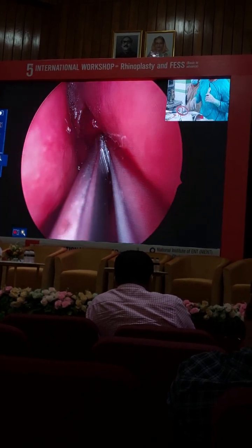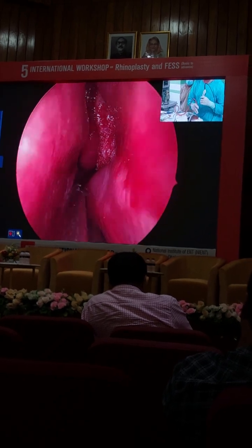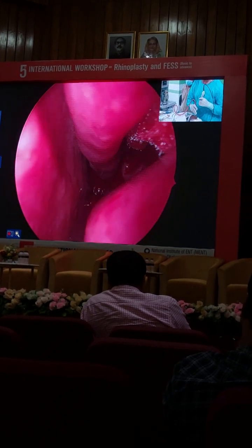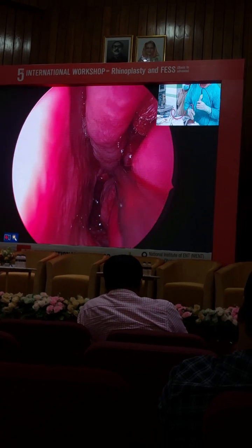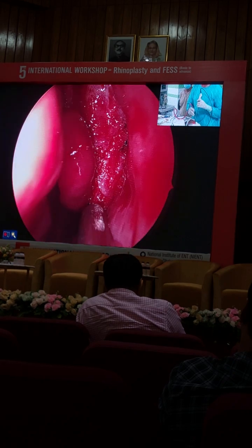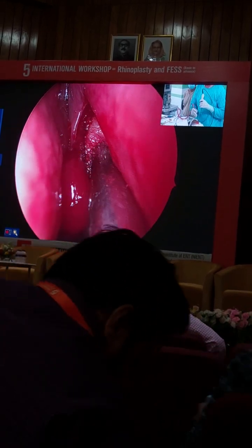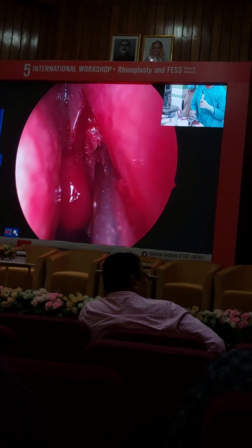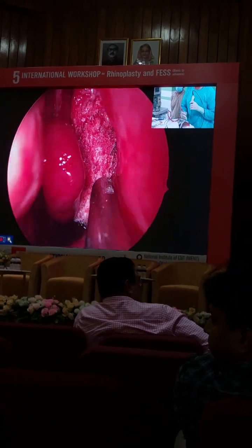And though I'm doing this more because I want her to see clearly, it's always a good idea to work with proper vision. Keep the field as clear of blood as possible. Also, then your image will not get dark. Okay, maybe we can try a little bit more.